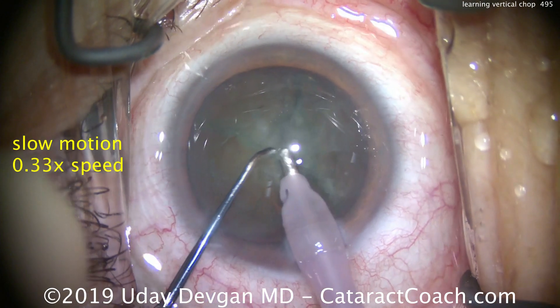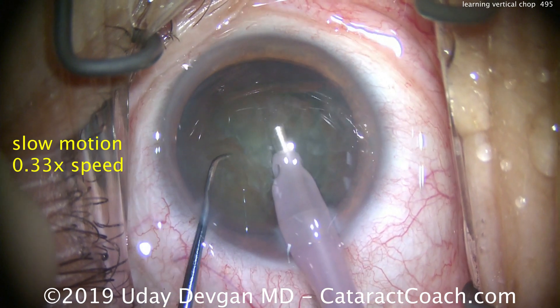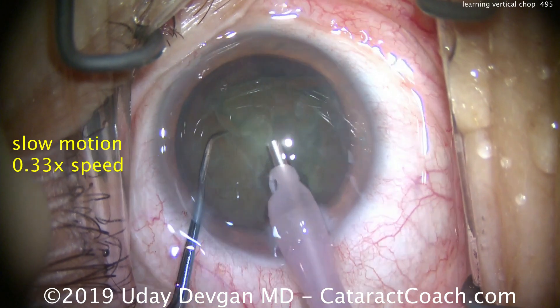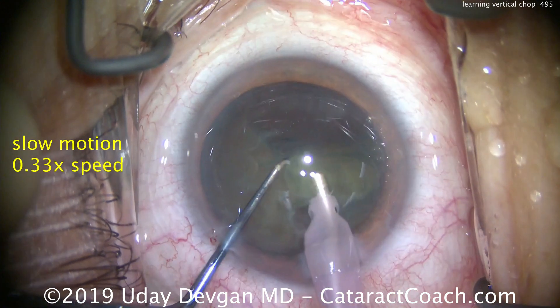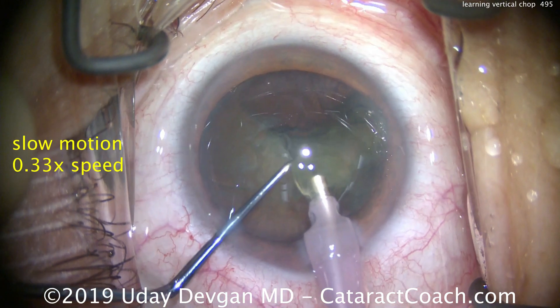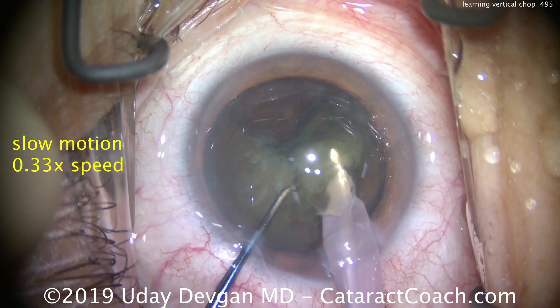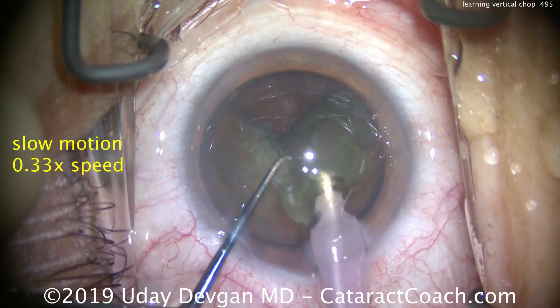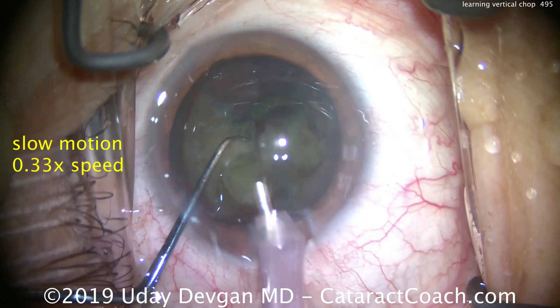There are natural cleavage planes that are created. Now that first small quadrant — buzz in with the phaco probe, bring it up, get it out of the capture bag, and emulsify it. There's that first quadrant that we've chopped, brought up using the chopper to keep it pushed in front of the phaco probe. Be careful — you don't want the nuclear pieces you're trying to emulsify under your probe; you want them in front of the phaco tip.